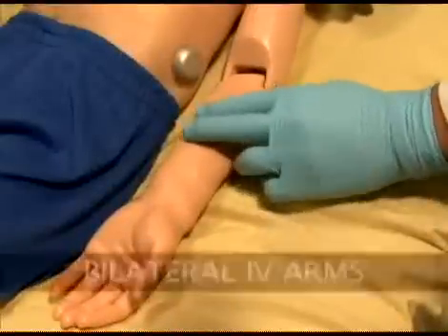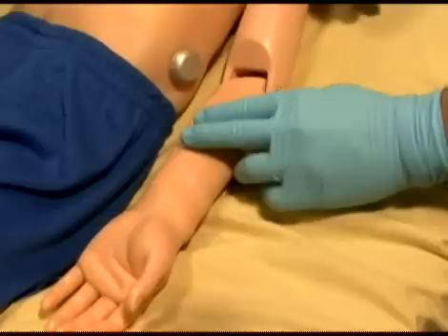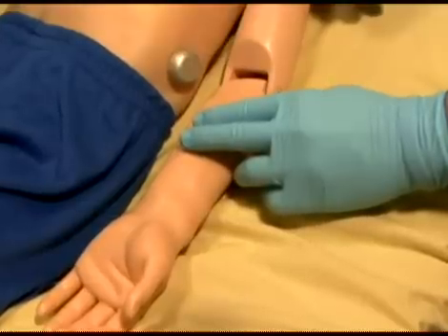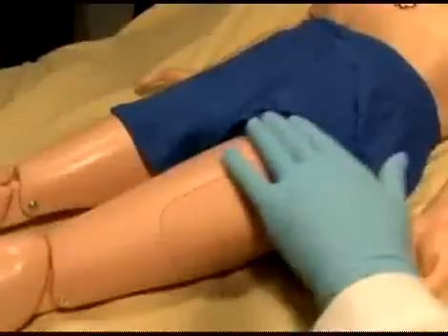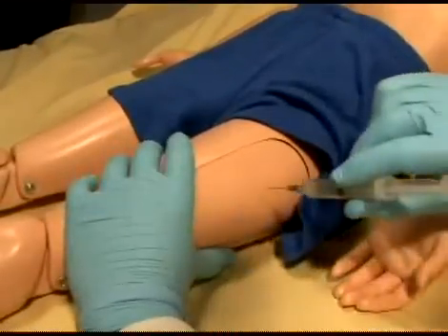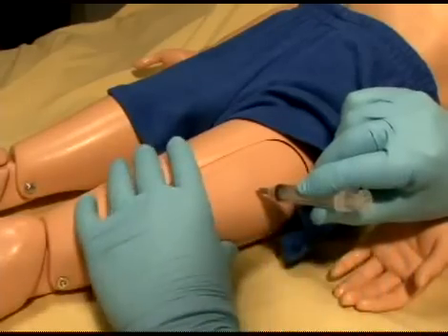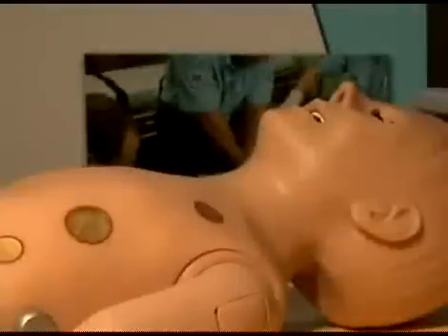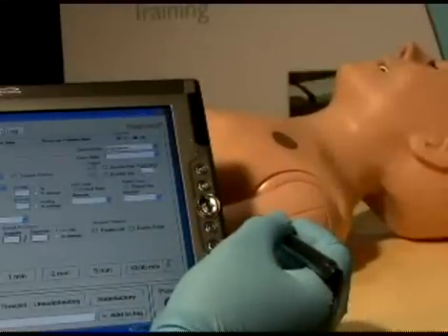Pediatric HAL has bilateral IV training arms that can be used for bolus or intravenous infusions as well as for drawing fluids. In addition, he has IM sites on both his deltoids and quadriceps. Pediatric HAL is outfitted with a convulsion mechanism that can be used in conjunction with scenarios. The severity of the convulsions can be programmed with a touch of the stylus.